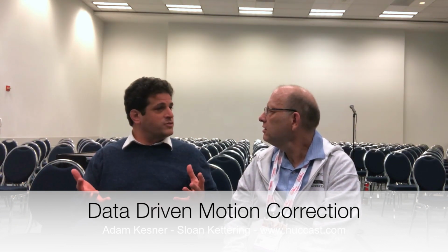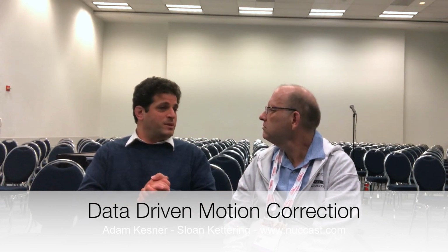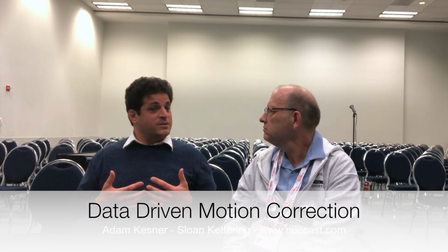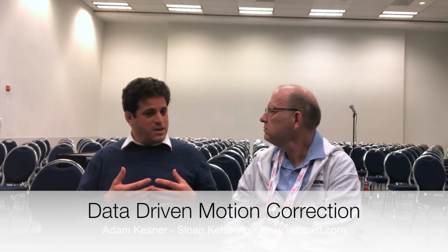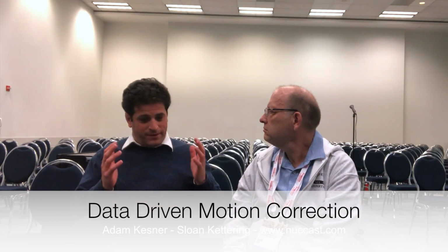The better your quantification, the better dosimetry calculations you'll be able to get, and that means you might be able to do a better job at tailoring patient therapies. So there could be real tangible implications of having easy to use motion correction, and we're going to see that. I'm fairly confident.